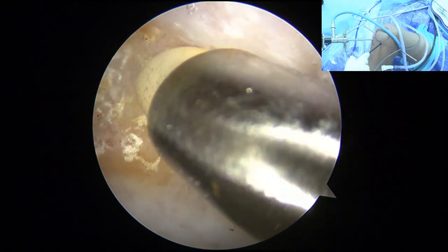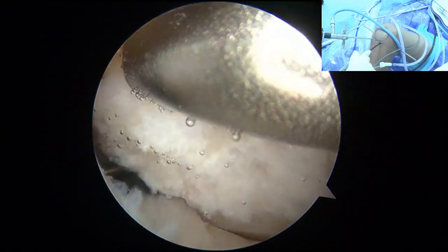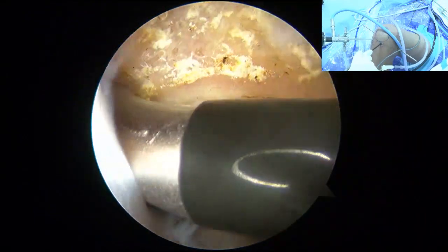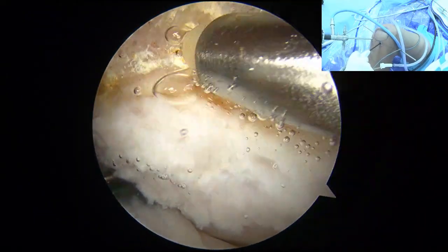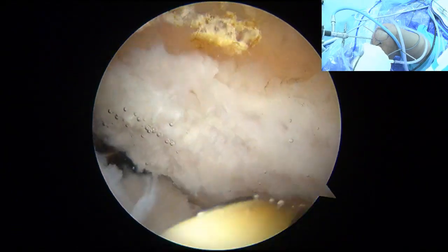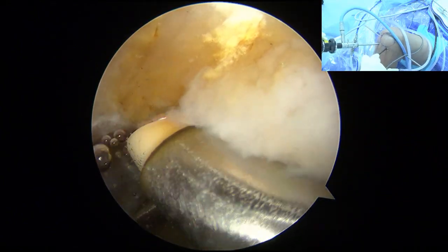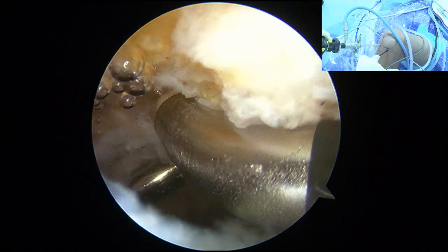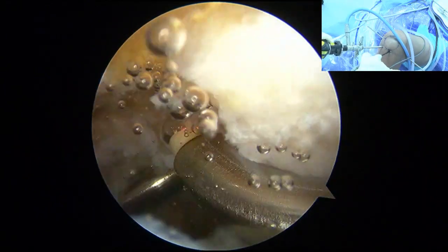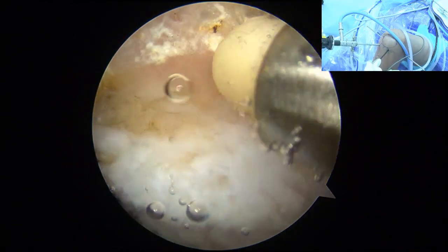Go. 那这一条线呢就是住院医师脊，它也叫股骨外侧髁脊。 Okay, if you do ACL above this line, you are wrong. 所以呢因为这条脊在往上就没有 ACL 的纤维了，所以如果 ACL 选点隧道定在住院医师脊上方的话，这样就违反自然了，是错的。 Okay, and this is over the top. 这是过顶位。 Right? So I always identify this over the top. I identify this resident ledge.